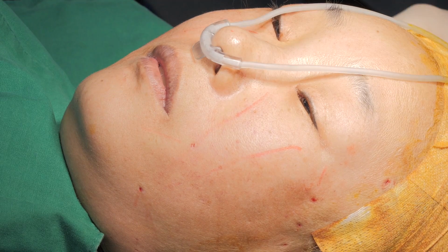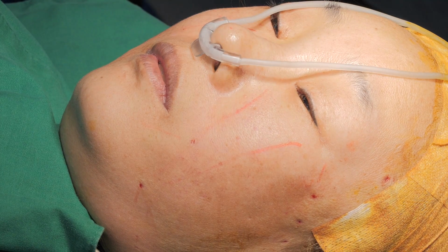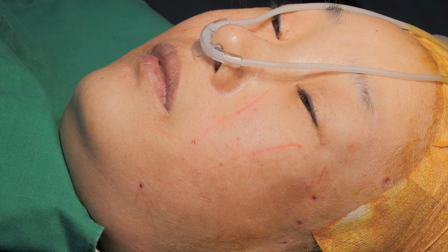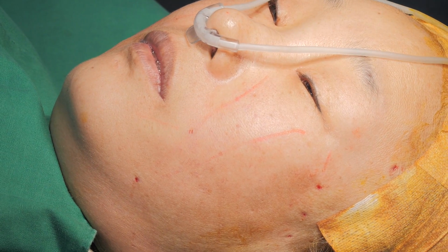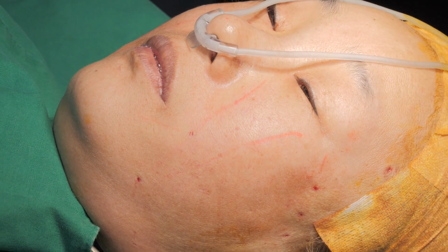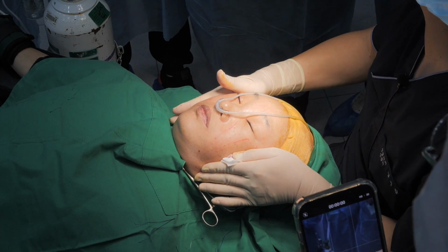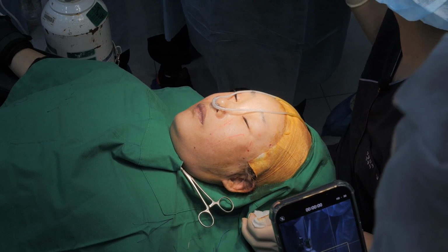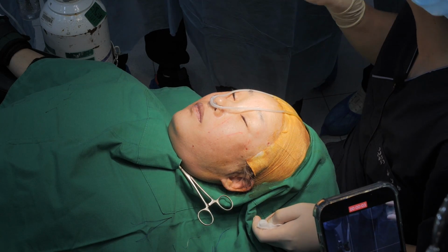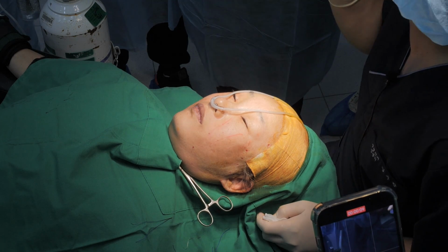I rarely use thin thread because I don't have to. But for the presentation today I will use it. So you use 19 gauge and now you're changing to 18, or the other way? Usually for lateral fixation, I want something strong. That's why I choose 18 gauge. But for medial, as I mentioned, I should choose a thinner one. We also have 20 gauge.